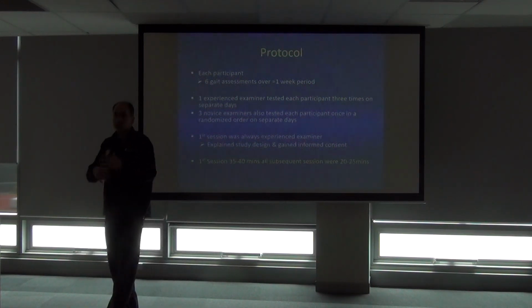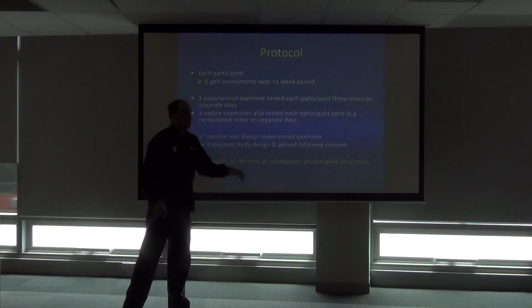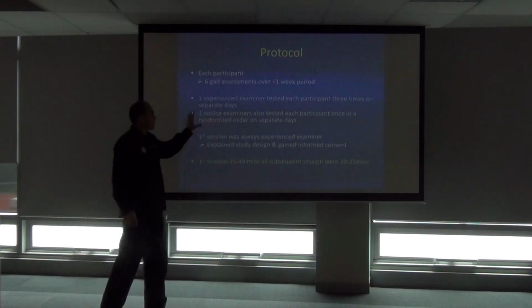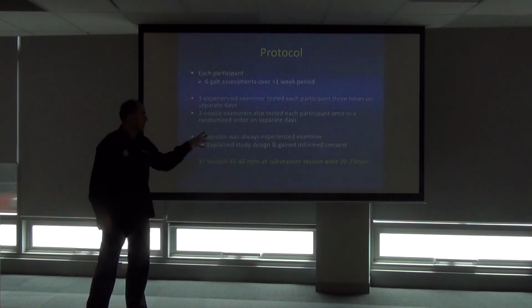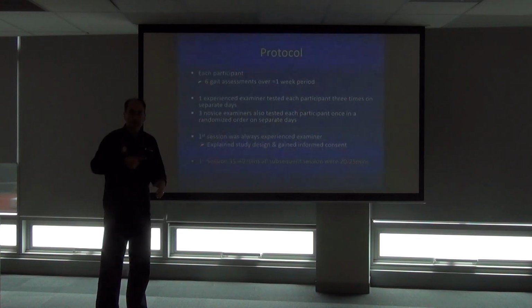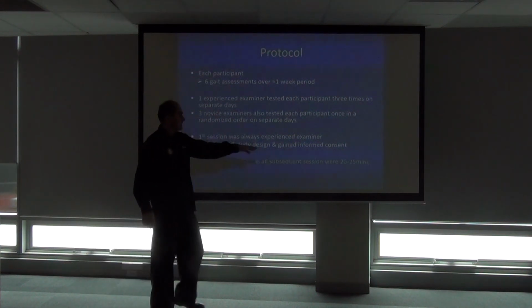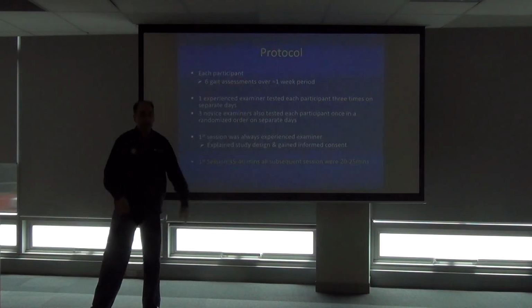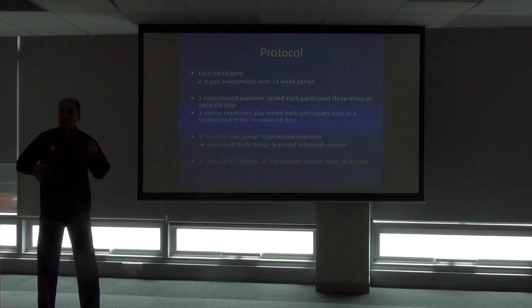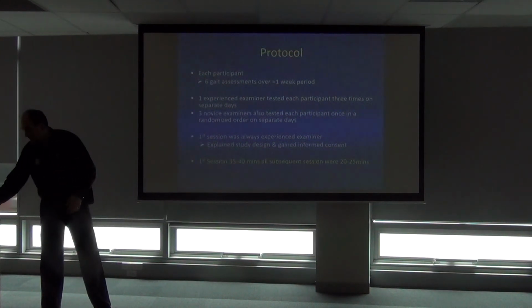So 20 to 25 minutes for the gait assessment, collect the data, and also, not included in here, we also collected skin folds. In that 20 to 25 minutes was also 6 sites on the lower limb skin folds, 3 sites each. That chewed up probably about 5 minutes, about 20 minutes. So reasonably quick, in and out, and not very complicated.